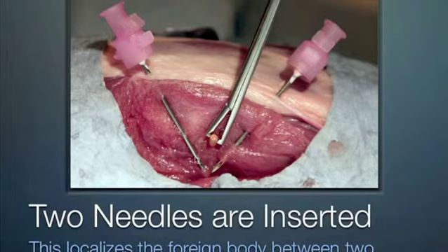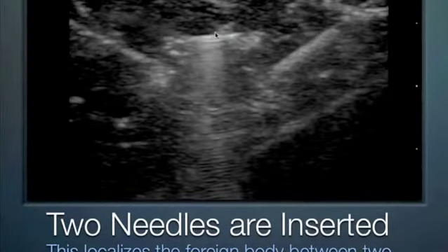And this is the example here of what this looks like. We took one needle here coming across, another needle coming here, and this is the actual grasper here with this reverberation artifact grabbing the wooden toothpick. So these two needles can localize the location in which to put the grasper.